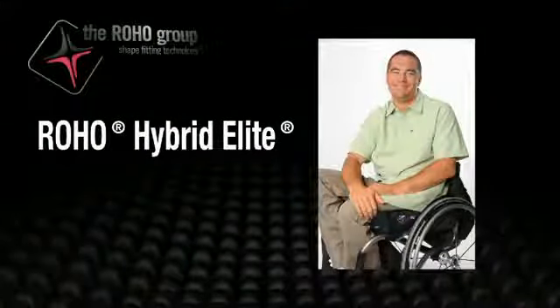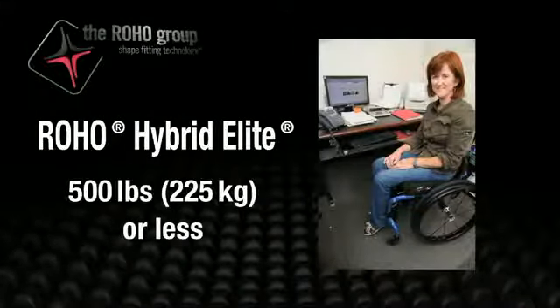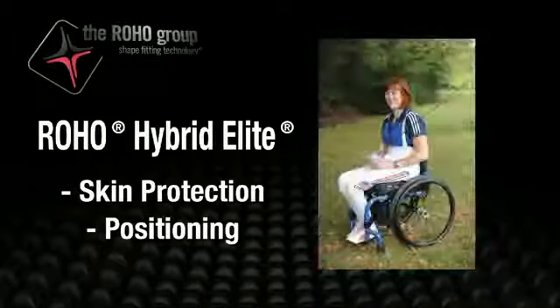The Hybrid Elite is recommended for individuals who weigh 500 pounds (225 kilograms) or less, and who may require skin protection, positioning, or skin protection and positioning while seated. Roho Incorporated recommends that a clinician, such as a doctor or therapist experienced in seating and positioning, be consulted to determine if the Hybrid Elite Wheelchair Cushion is appropriate for the individual's particular seating needs.